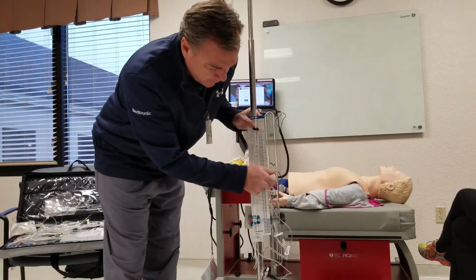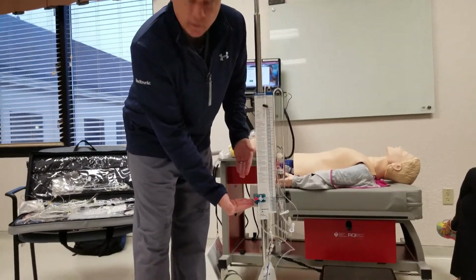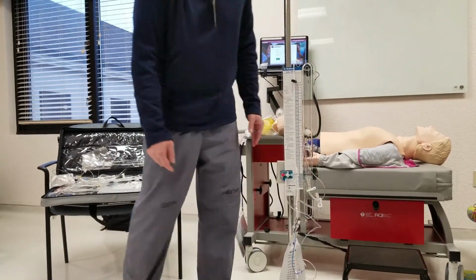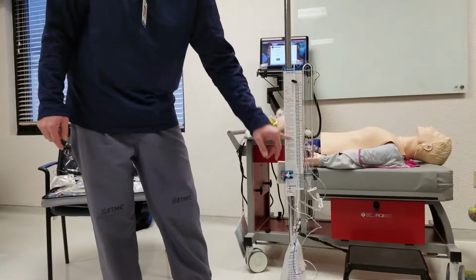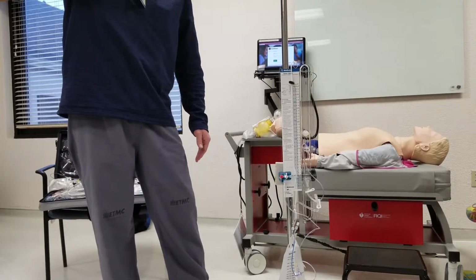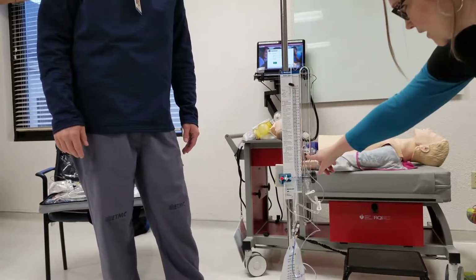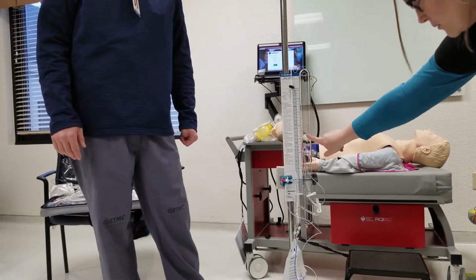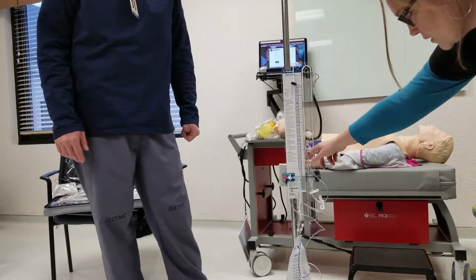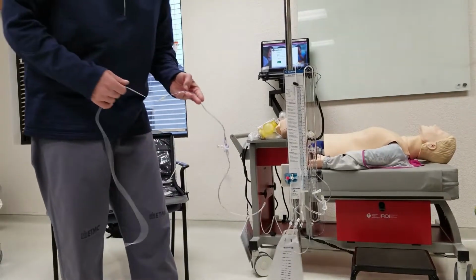We lock that down, and now because this is the 0 point, it's got to go uphill, and gravity is your regulator, which is why this is a perfect graduated scale. It just fights gravity, and when it gets to a certain pressure, it can get over that hump. I want to point out too, guys, the pressure level is right here, not according to the dial up here. When you see the line, that's where you want that pressure level to be. I know a lot of people move it up and down for the little dial, but it's not supposed to be.